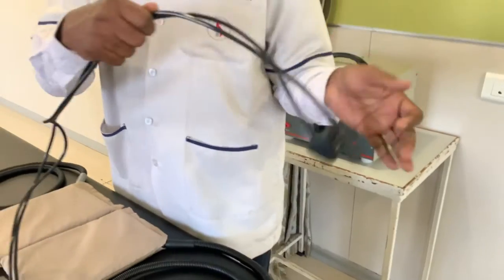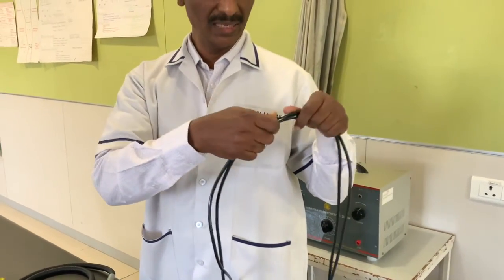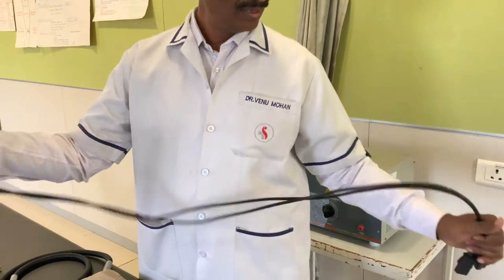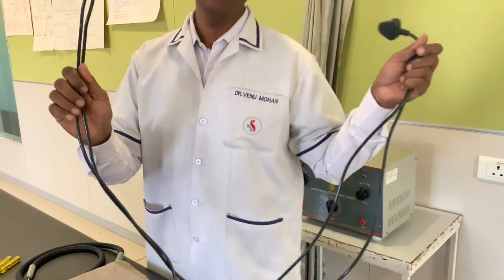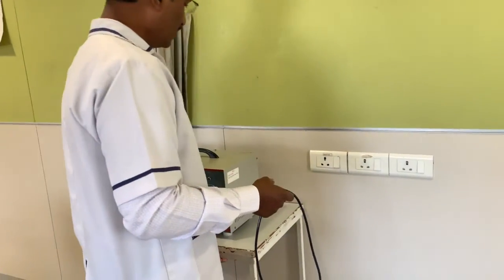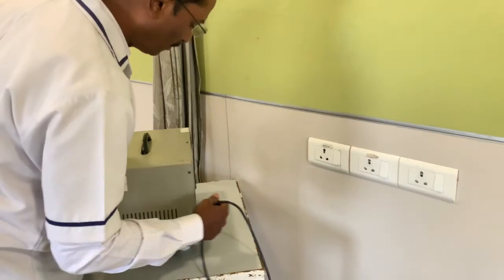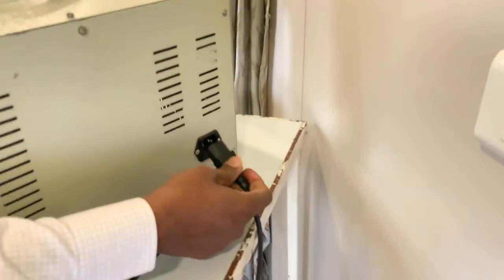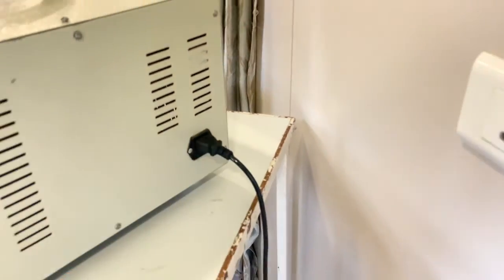We need to check the integrity of the cable physically, and check for any damages. If you find any damages, you need to change this cable. Since our cable is in very good condition, we can continue with testing. We have a power socket. On the posterior aspect, it has a fuse. This is the point where we connect the mains cable or the power cable.